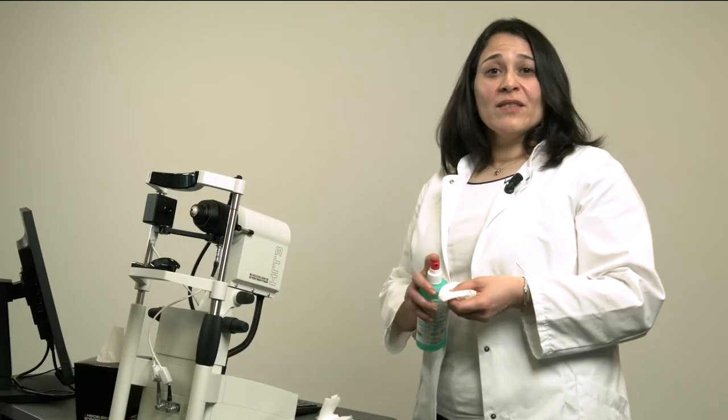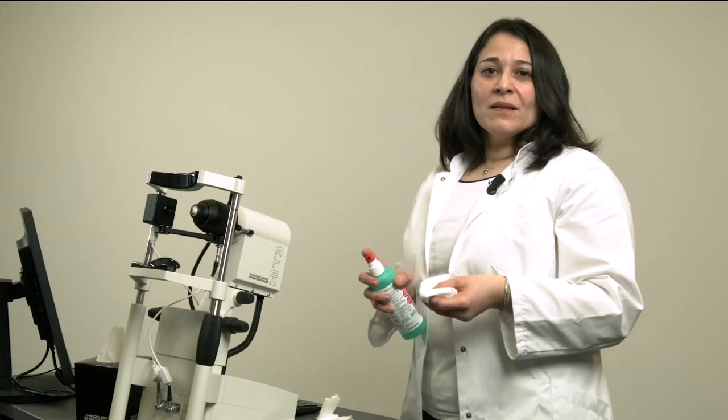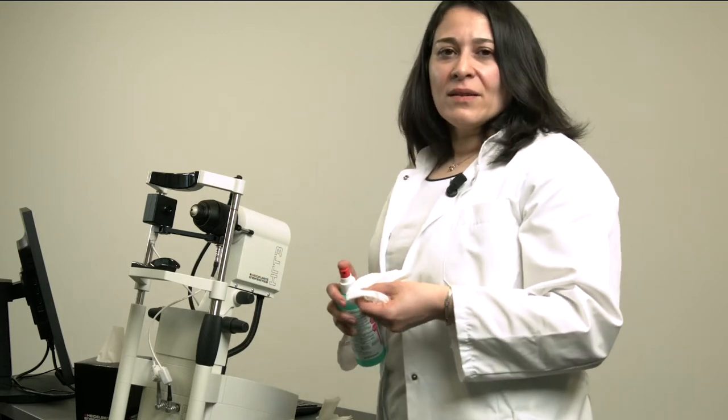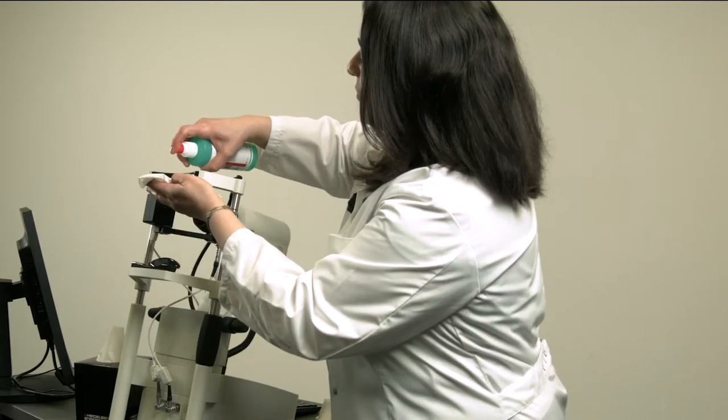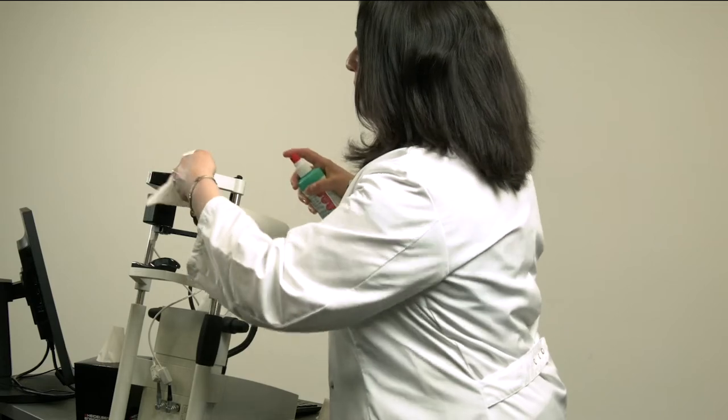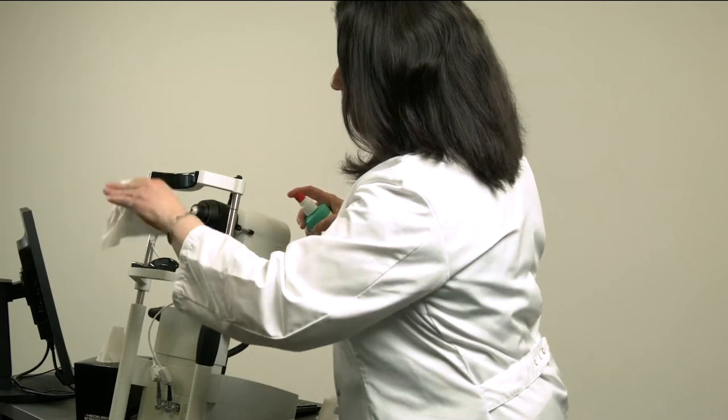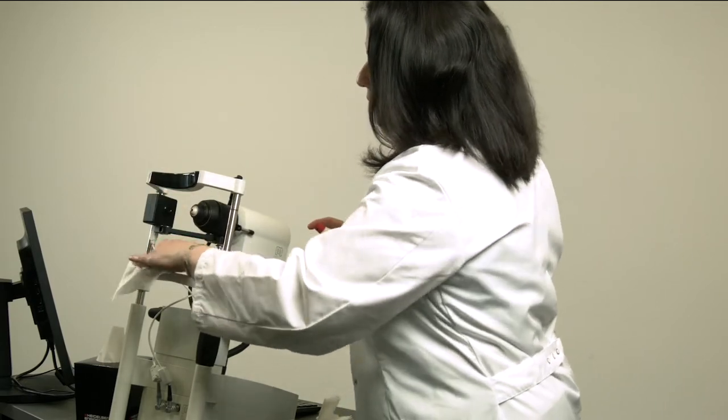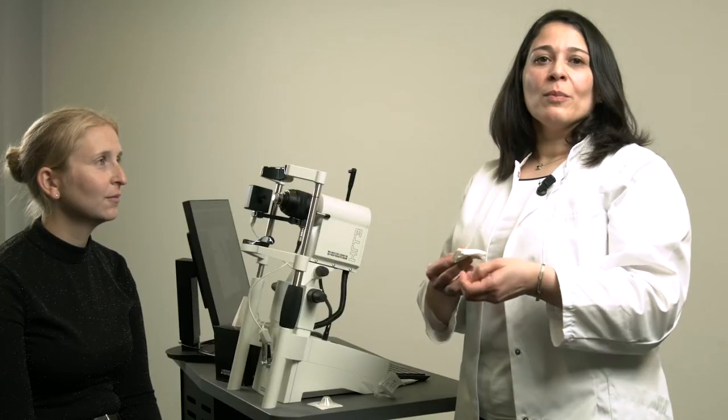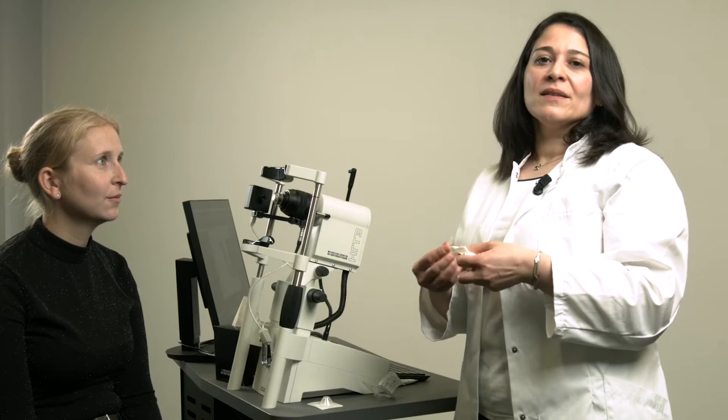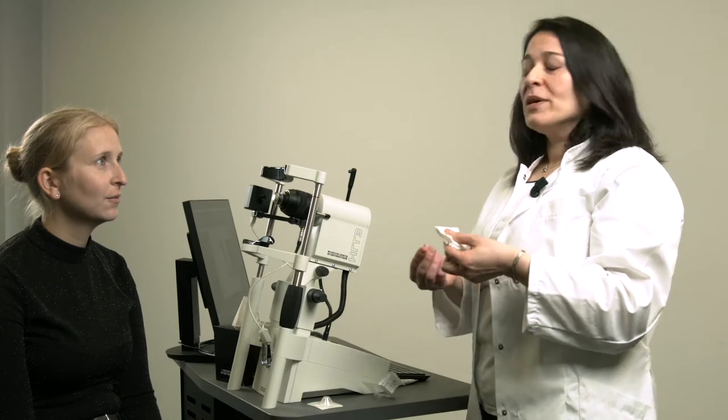This will ensure that you will see an intracorneal structure immediately when the tomo cap has contacted the cornea. Now we will do a patient examination. Before that, the chin and headrest are cleaned and disinfected as usual.